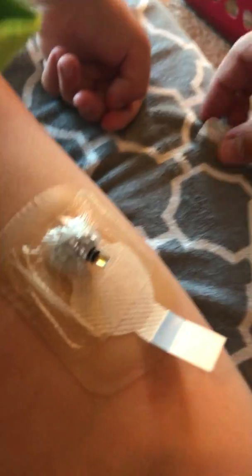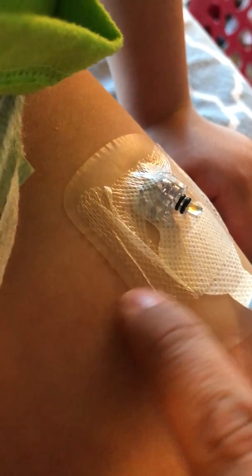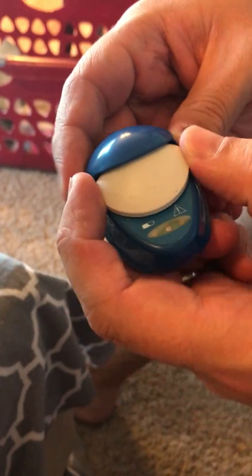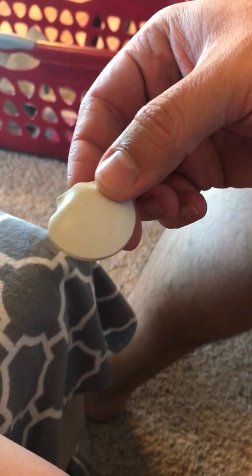There you go. Okay, so you can take a look, and we forgot the sensor. We'll grab that quick. So right here you can see this is that overlay, and we kept it on the Tough Pad so it's not touching his skin. One thing I forgot to tell you that you also need is the actual sensor. It was in the charger. It needs to charge usually about 20-25 minutes. It stops flashing when it's done. Before we insert it, we want to make sure there's no flashing lights.